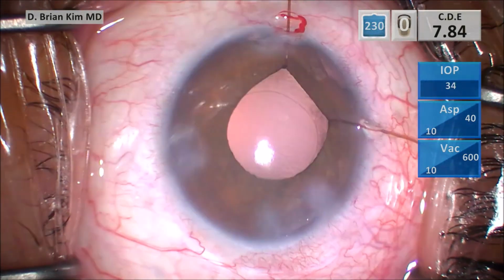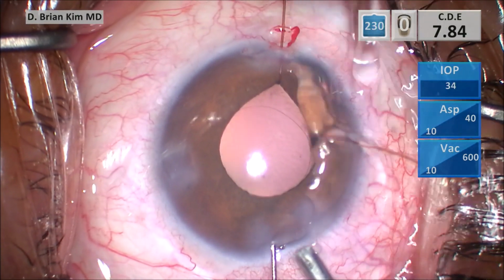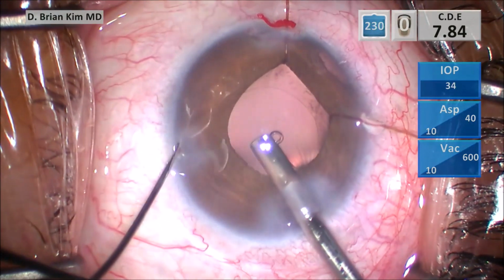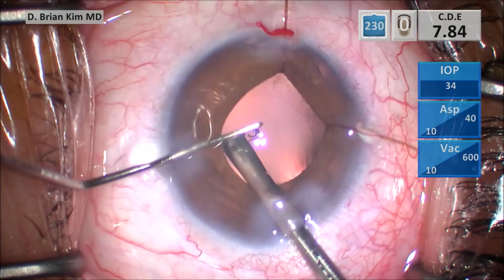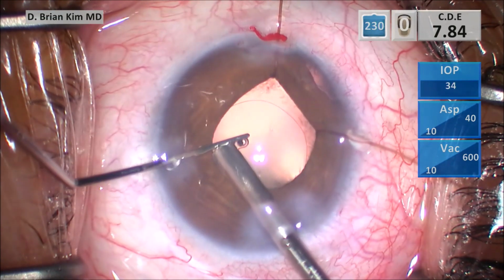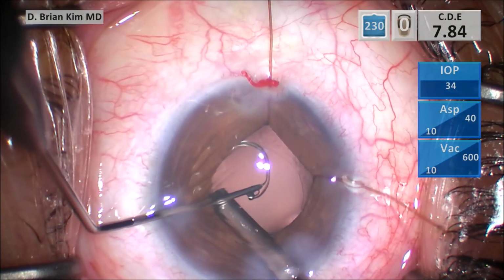the leading eyelet, which basically compresses the ring into a smaller diameter. And by compressing it smaller, it minimizes any torsional stress on the capsular bag. So here it goes. Hook the leading eyelet with the Lester, deliver the CTR into the bag. You want to make sure it's down into the bag.